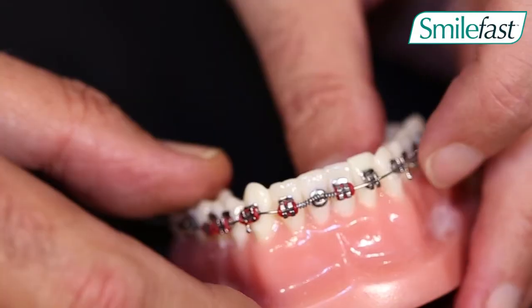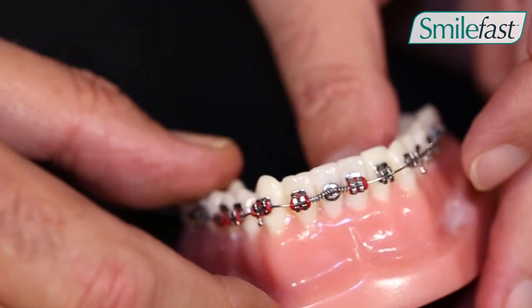We usually have our assistant holding the open coil spring as we tie the adjacent bracket in.